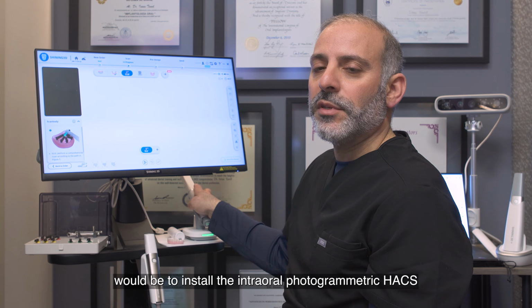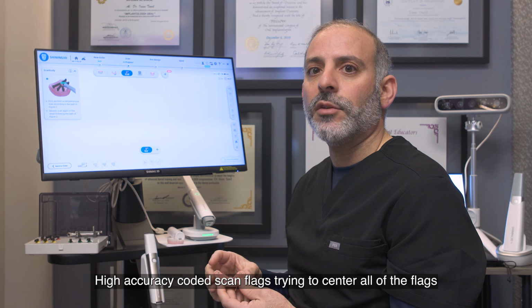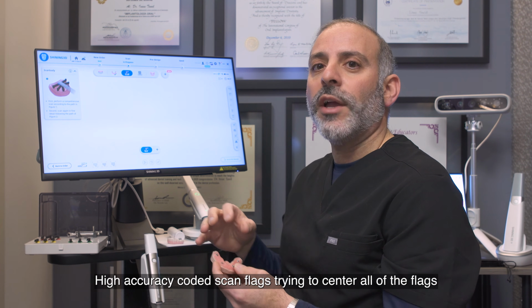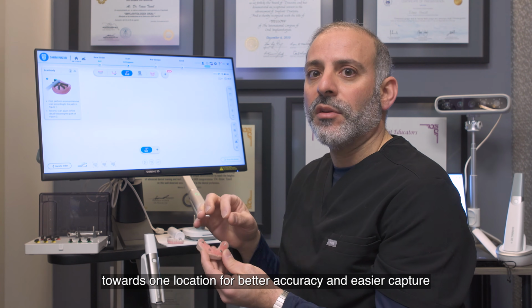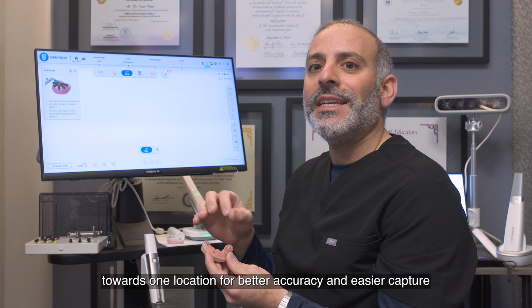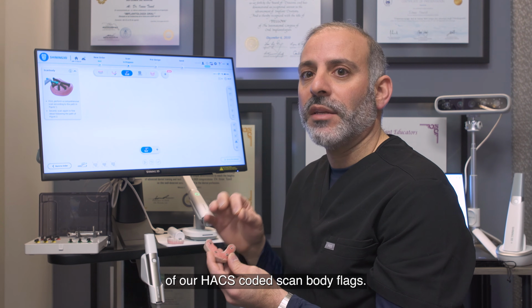The next step would be to install the Intraoral Photogrammetric HACS high accuracy coded scan flags, trying to center all of the flags towards one location for better accuracy and easier capture of our HACS coded scan body flags.